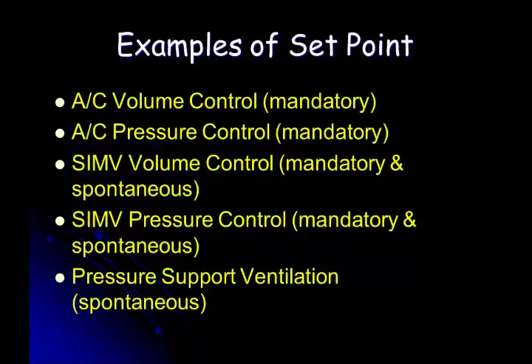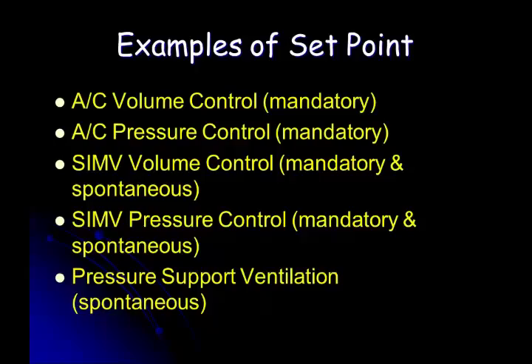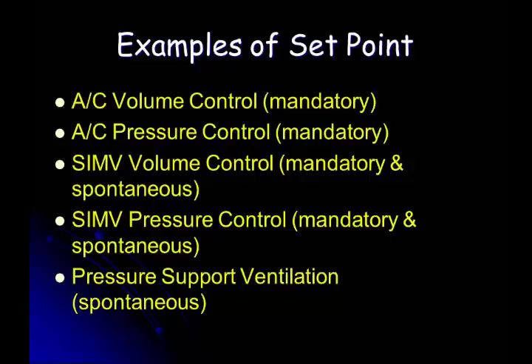I just had a question. You know how you just said every breath is ended by the machine? Is that true in the assist and the mandatory? Assist control is a mandatory form of ventilation. There are only mandatory breaths, only mechanical breaths. There are no spontaneous breaths. Can I say that again? Listen closely. Write this down. In assist control, there are no spontaneous breaths. Every breath is from the machine. Patient can trigger it, but every breath is ended by the machine. So therefore, they're all mandatory or mechanical breaths.